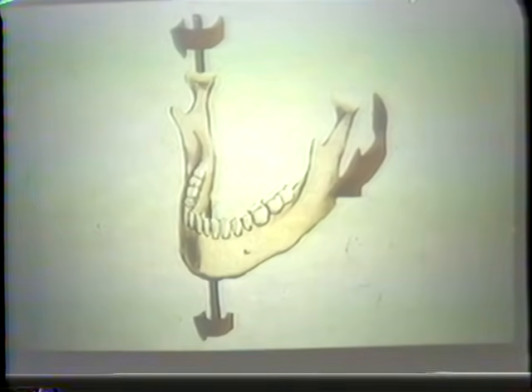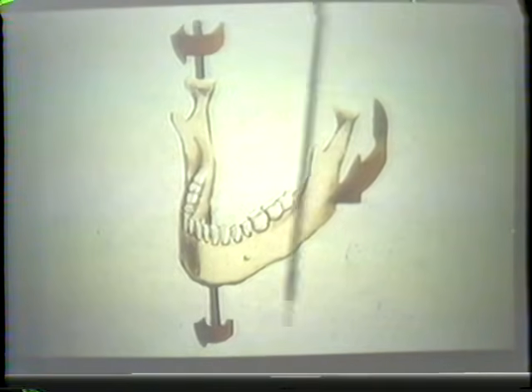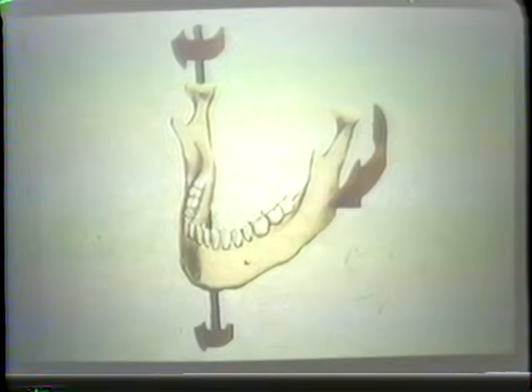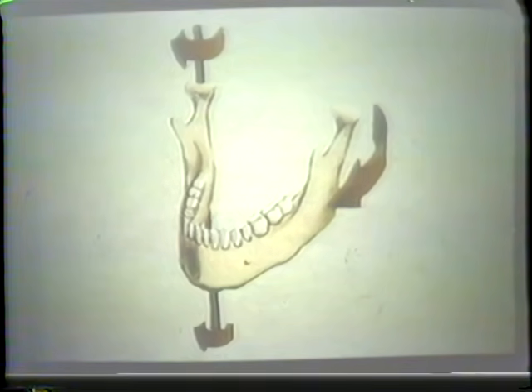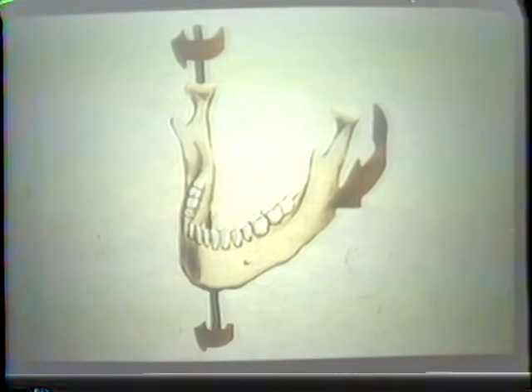All right, the other axes we're concerned with are the vertical axes. We have one on each side. Of course, one when the mandible moves about, let's say, towards the right, and then the other side, of course, moves to the left. Now, this position becomes critical in terms of the maxillomandibular records that we need to make in order to make this location.